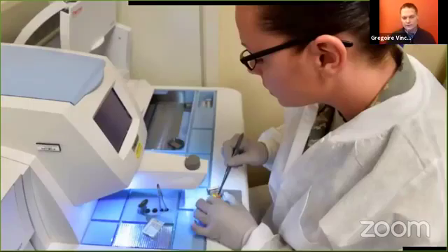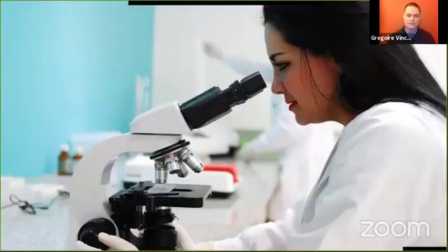This piece of tissue is processed by laboratory technicians to prepare it to be seen by a pathologist, and you slice this sample in very thin layers of a few microns. Then the pathologist sees this very small slice under microscopes to see what the cells are and how they are organized. But if you don't prepare your sample correctly, you will not see everything. The image will be pure white and you will see nothing. So for digital pathology, compared to medical imaging, you need a lot of preparation of the samples.